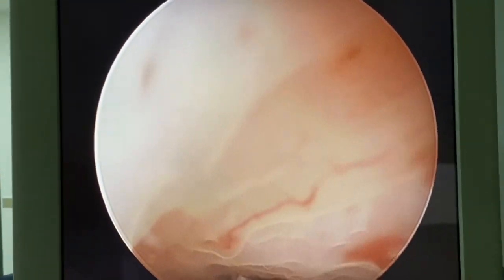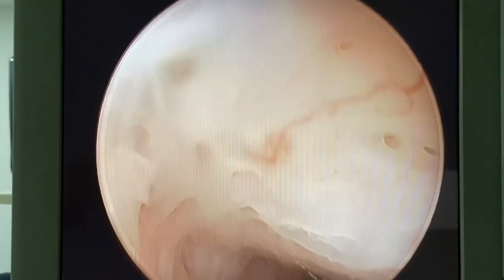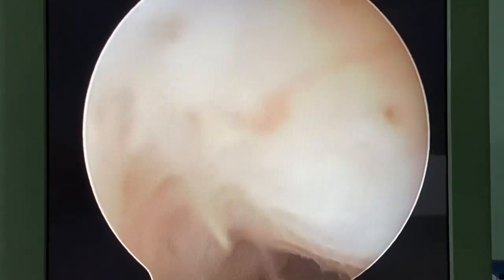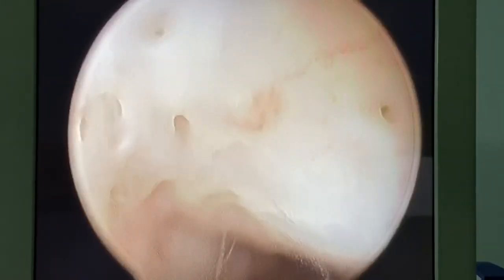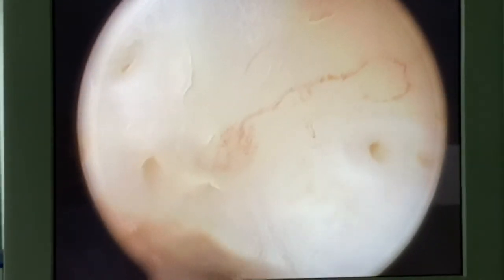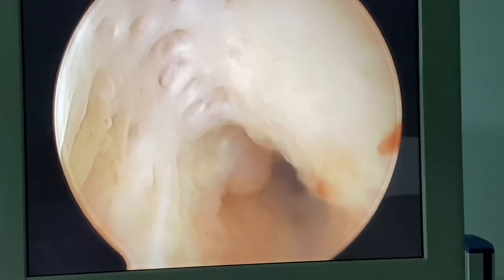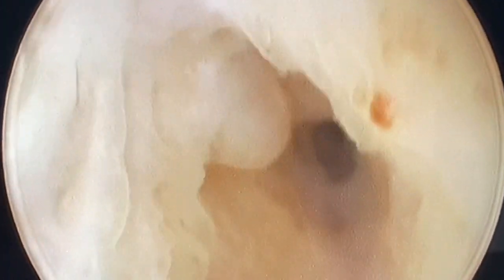That's the endocervix. You can get very fine details by adjusting the focus. You can see the RBCs flowing — that's the level of detail you can achieve. You can check for any pathology in the endocervix. You have to change the focus every now and then. These are the endocervical glands.